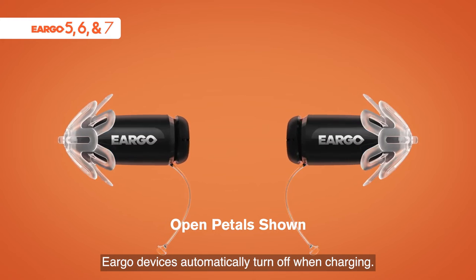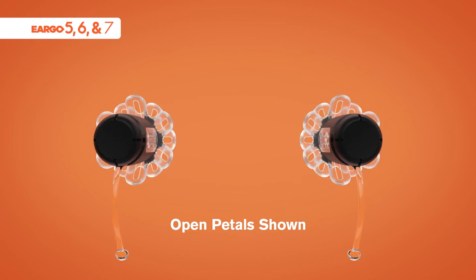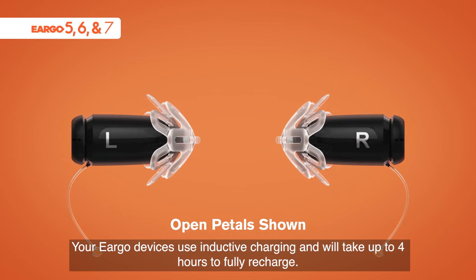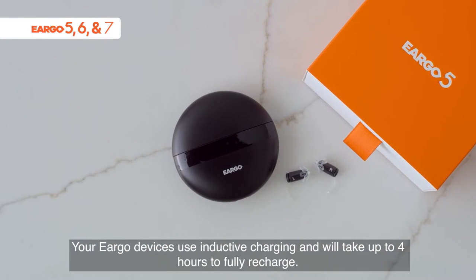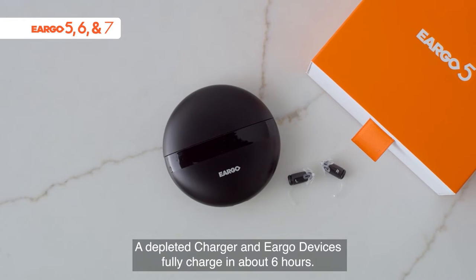Eargo devices automatically turn off when charging. Your Eargo devices use inductive charging and will take up to four hours to fully recharge. A depleted charger and Eargo devices fully charge in about six hours.